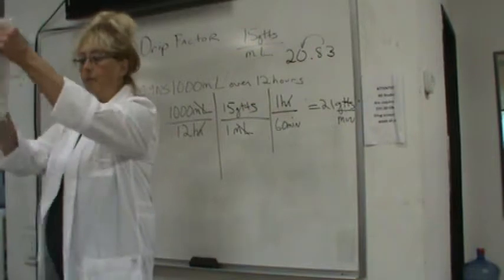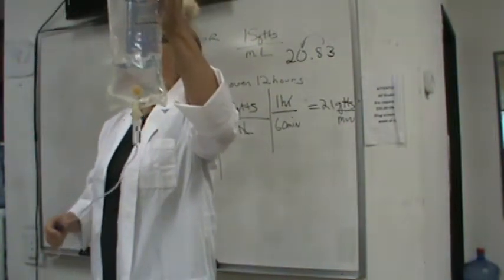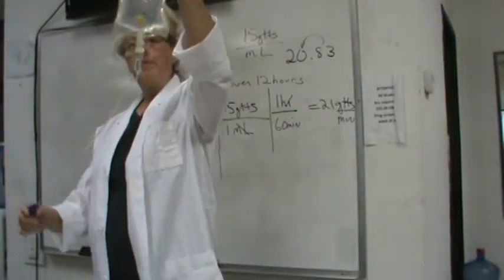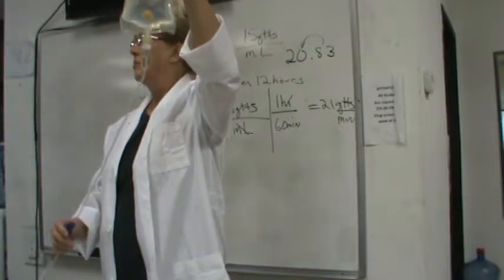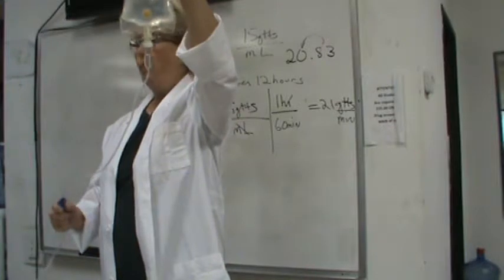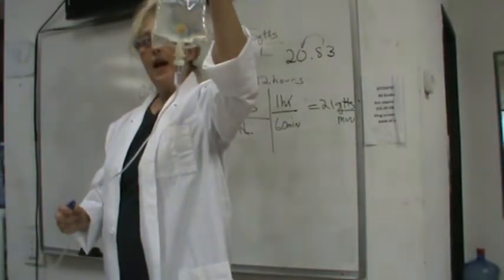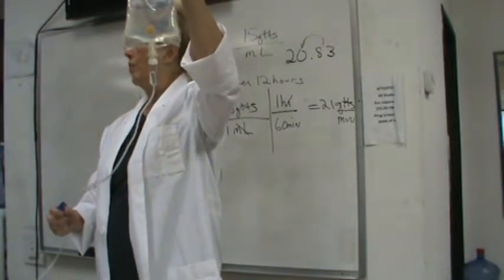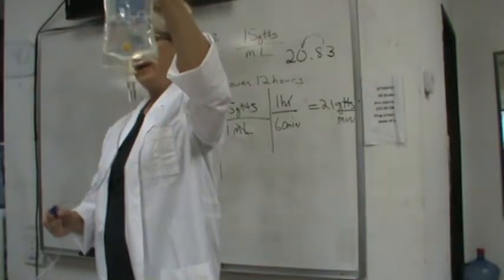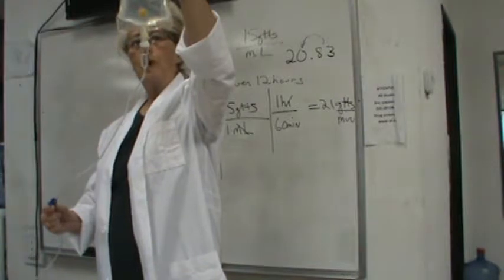Well, basically, we're going to hold this up and look at the clock. Right now mine's not even dripping. Probably yours isn't either. You hold it still. We have to open this ever so gently so that we can start counting 21 drops in 1 minute, right? So let's look at the second hand on the clock and see if you can get approximately 21 drops per minute.